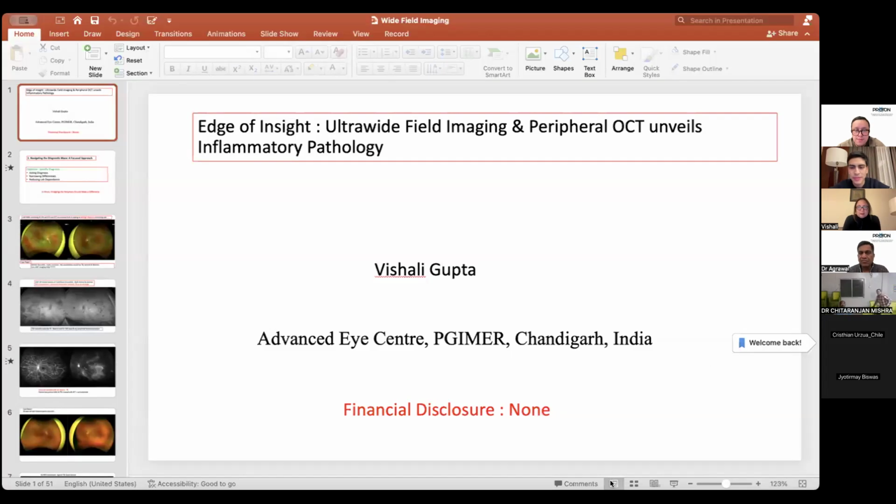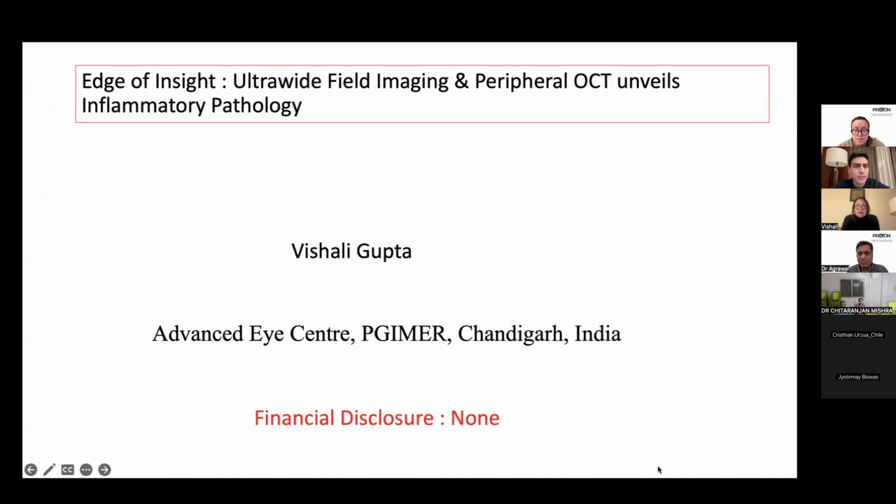Thank you, Rupesh, William, Carlos, and the entire Proton team for being here this evening. So I'm going to talk about wide field imaging, ultra wide field imaging, and the value of peripheral OCT in inflammatory pathology.